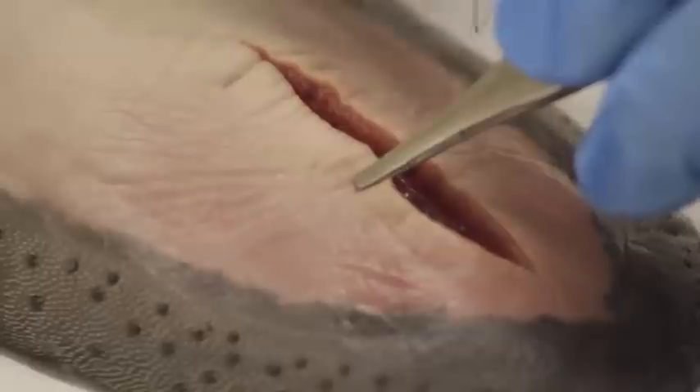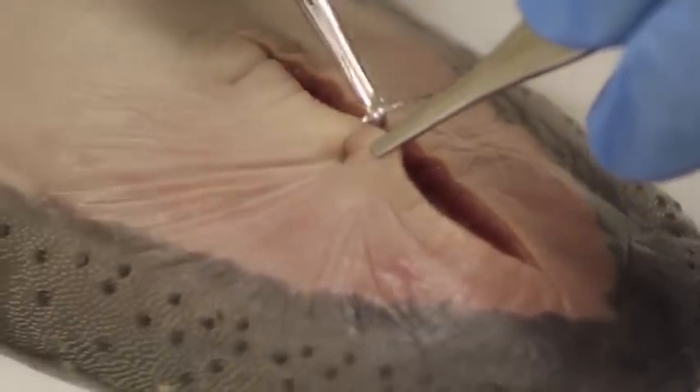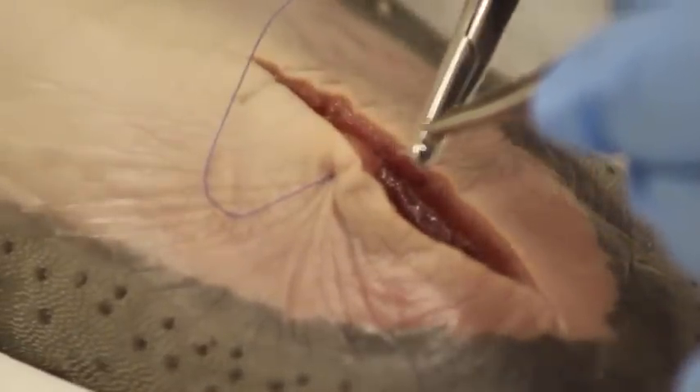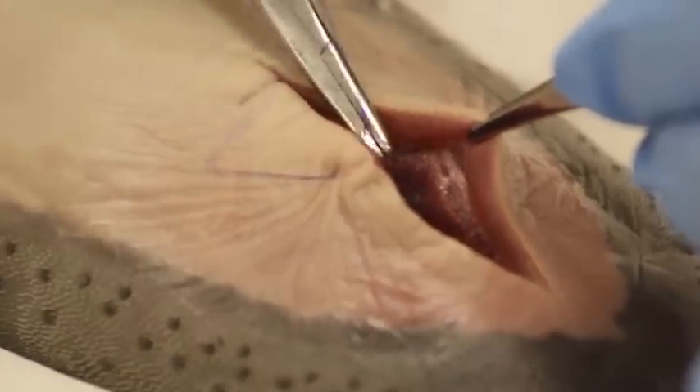We hold it and take the needle perpendicular to the skin, because you want to grab more at the base than on top. You come through the wound, grab with the forceps, then go on the other side — again grabbing more at the base than on top.